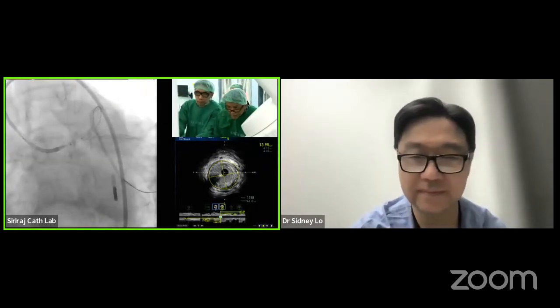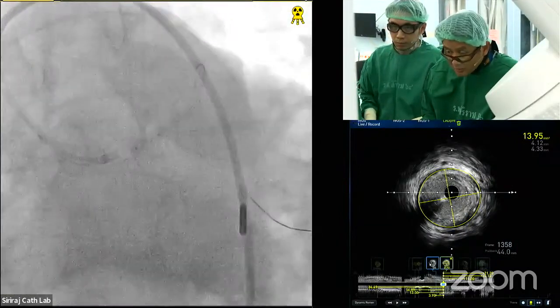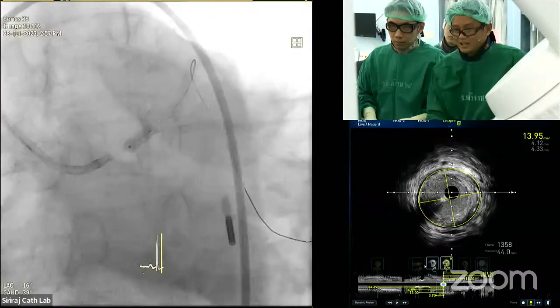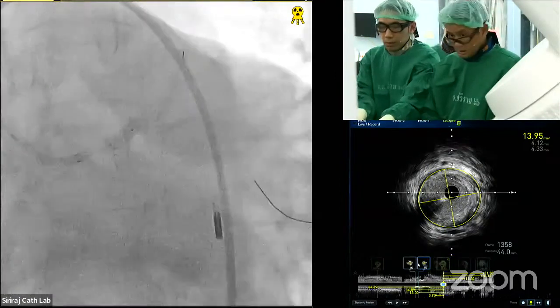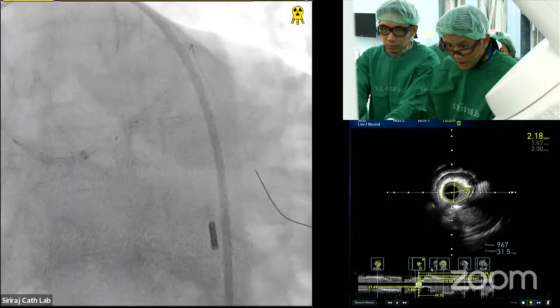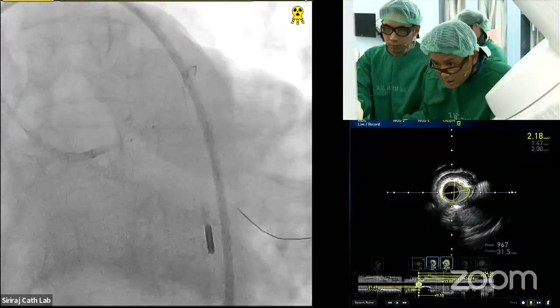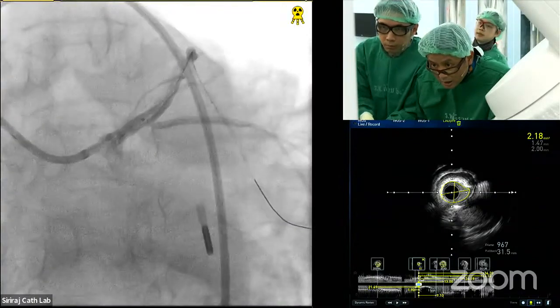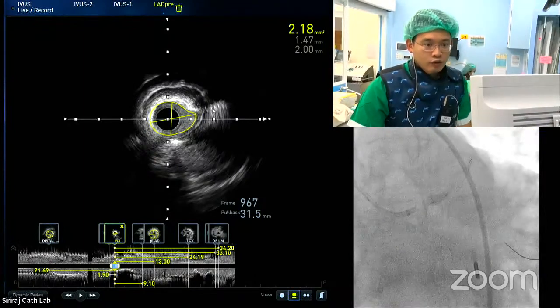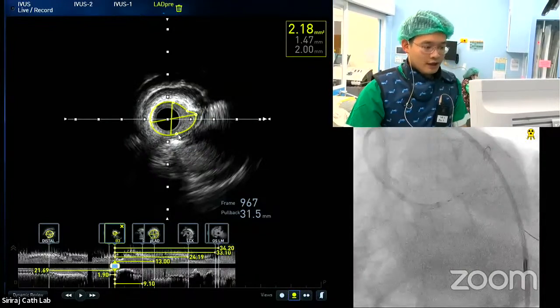Yeah, I think I agree with that. We have the side hole, I forget about that. If doing FFR deep enough, adenosine will be a challenge. But we can look, Pariyat can give us the MLA on that LAD. At the mid LAD, I heard the panelists mention that. This is the mid LAD just distal to the diagonal, where I have a calcification. The MLA there is 2.2, which, from the anatomy, could be a hemodynamically significant lesion.